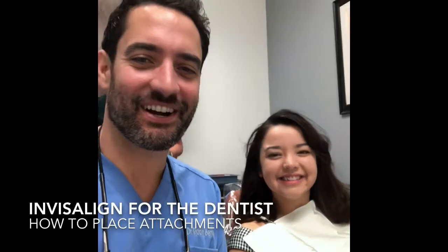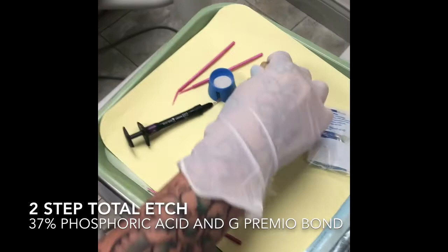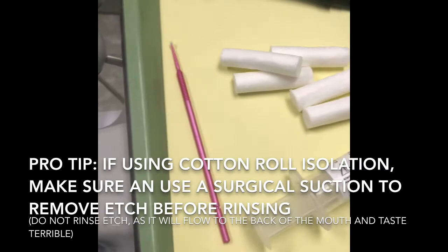We're going to talk about how to place Invisalign attachments. We have Jennifer who has allowed us to video her case. Melissa has everything set up - here's the attachment setup with G Premio bond, normal pumice from the pumice bucket. Never use profi paste. She's going to wet that in her Brassler profi head, along with some cotton rolls for isolation and paper points.